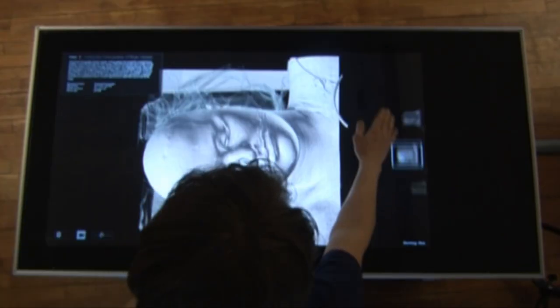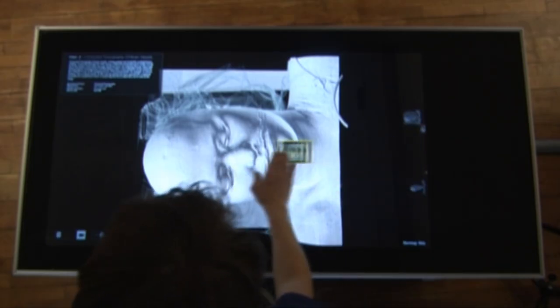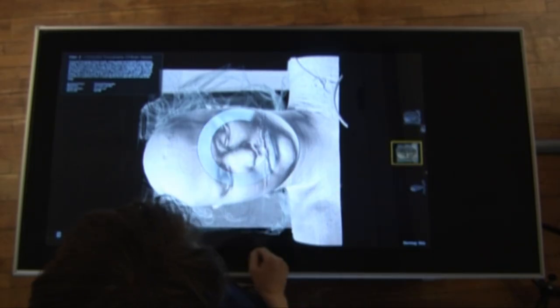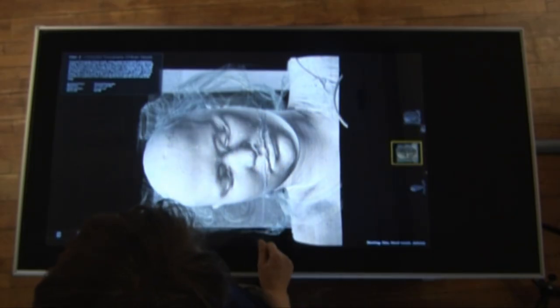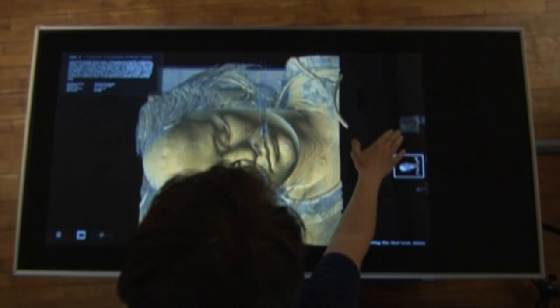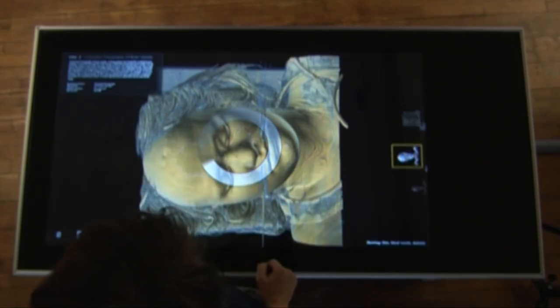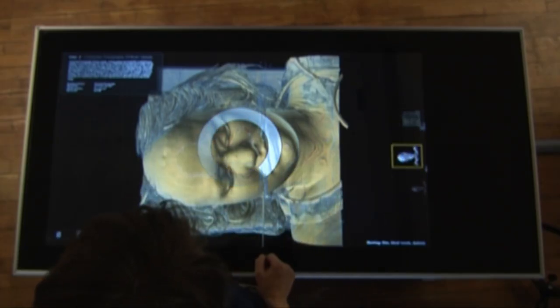The user can remove certain layers of the body. This makes it possible to look inside the volume and focus on specific details, such as the brain, the skeleton, the heart or the skin.